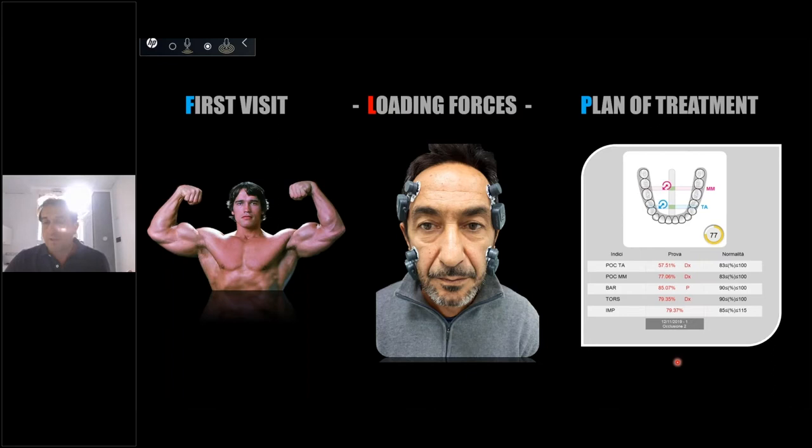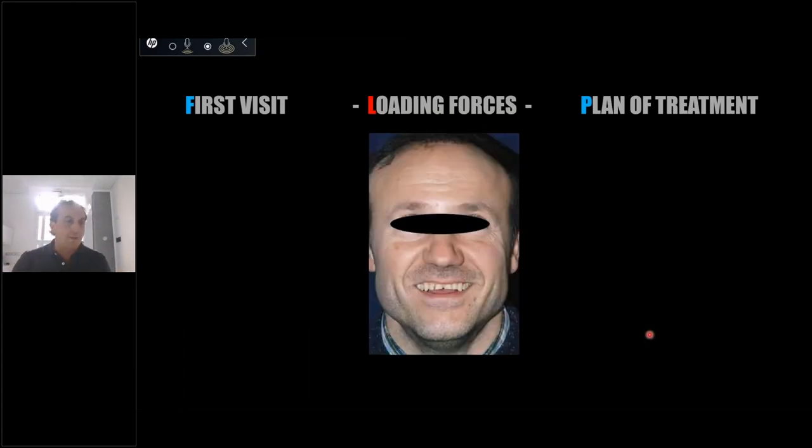And I can improve this data with my therapy, you know. But you can't always have this situation. For example, in this case, this patient comes to my dental office and asks me for a visit to improve the function because he has some teeth broken, and he wants to improve the function of his mouth. Okay, I look at this patient, and I said to him, "I think you are a strong man, and I have to change my therapy in this case because I have to improve the resistance of my, for example, ceramic."